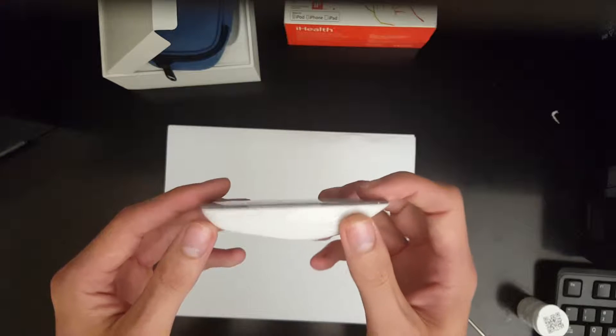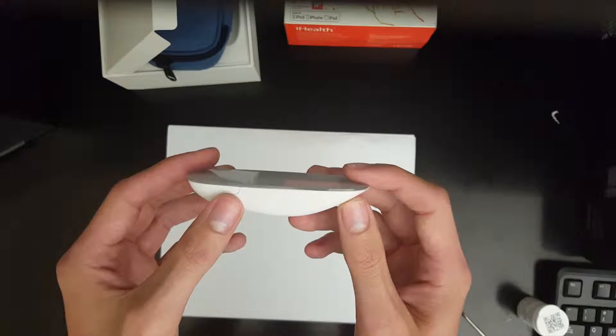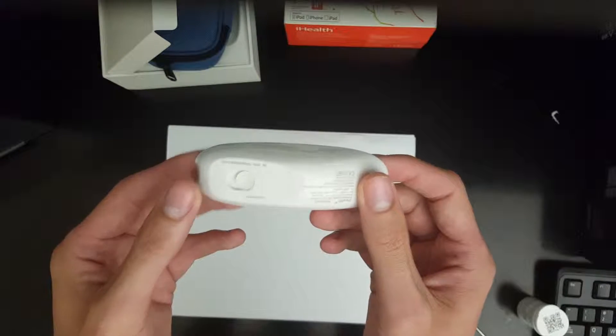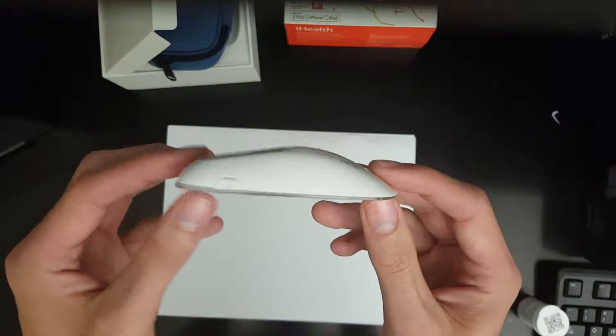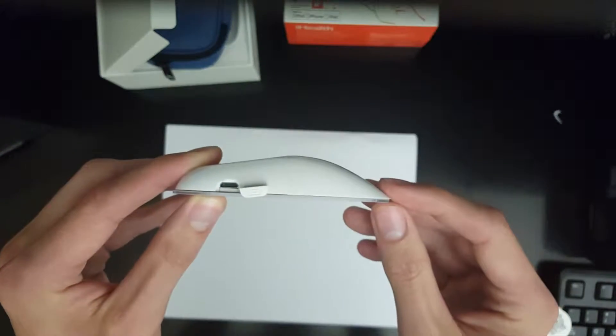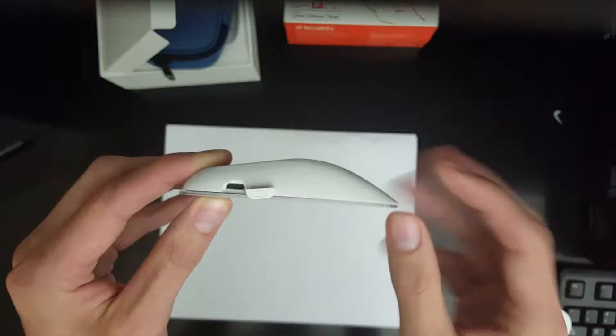This is the main glucometer device. On the side here is the power button, and on the other side is a micro USB port, which we open to charge the device when needed.